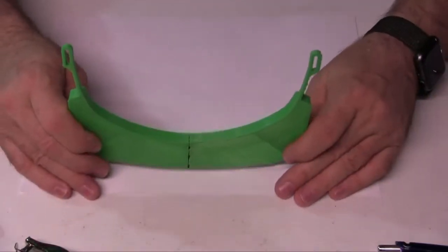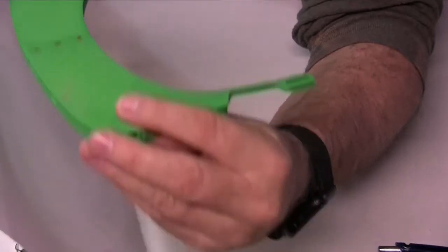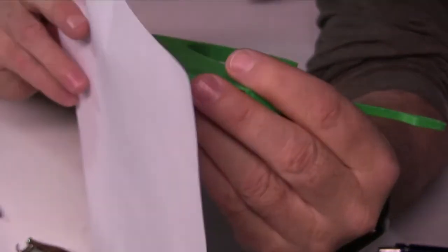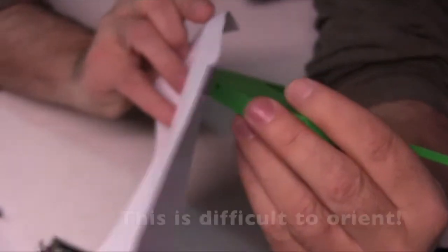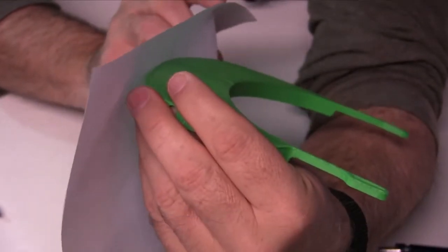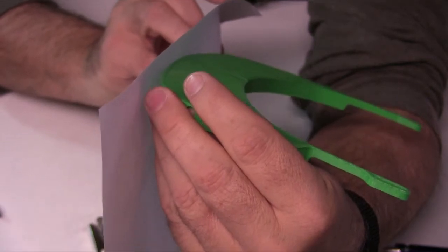Now if we take our frame and we place it on, what you'll see here is we want the plastic sheet to go slightly above, it's a little disorienting, we want it to go slightly above the frame, not right on the edge. We want it to go above like that, so there's some protection up there. So I'm going to be aligning this.